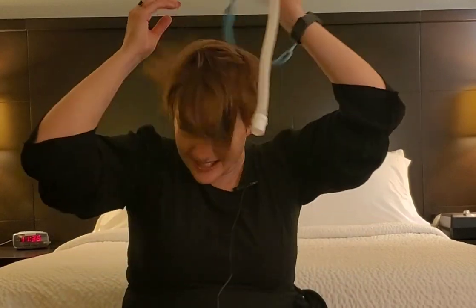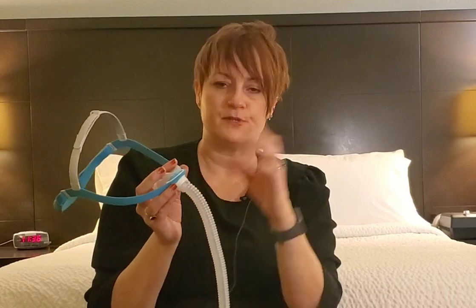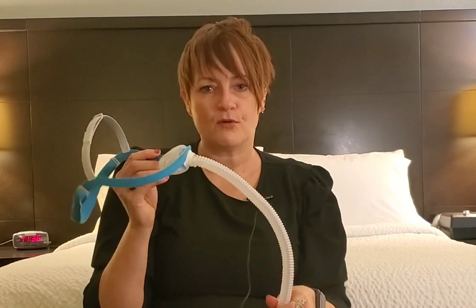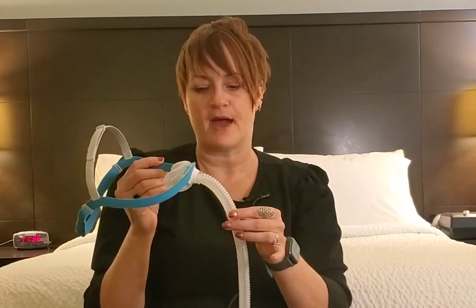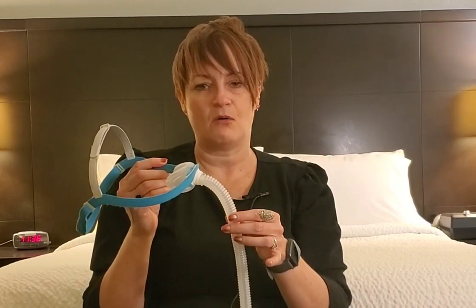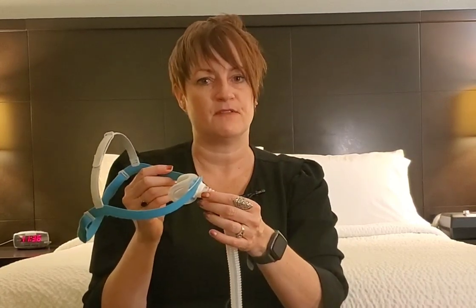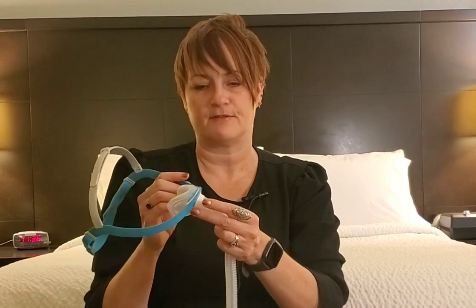It's not as silent as some of the other nasal masks are, but it has the hole shooting straight out the front. So those who complain about too much back pressure, this is perfect for you. You're going to get a nice small, low profile, reasonably quiet mask without that back pressure when you try to exhale from the fine mesh of some of the filter type ResMed masks.